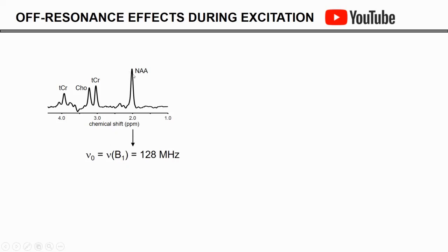So in this picture, the NAA, N-acetyl aspartate, resonance has the same frequency as the applied B1 field. Both are 128 MHz, and in this case NAA is said to be on resonance. On resonance, the magnetization rotates nicely around B1 over a flip angle alpha, as I described in the previous slide.